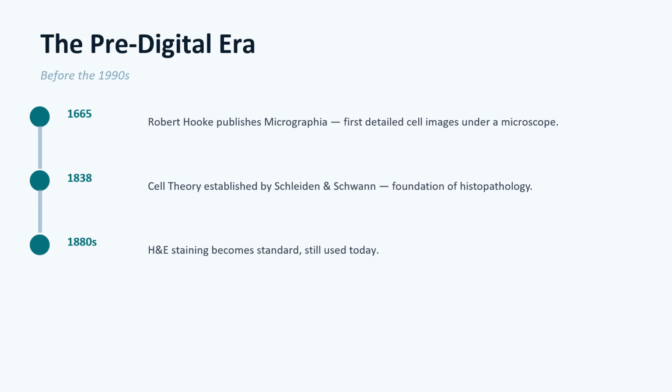The pathologist sat at a microscope, the glass slides were reviewed, and the diagnosis was rendered. A remote consultation would mean physically transferring the slide from one place to the other. And these slides may be broken, they would fade over time, and all those challenges.